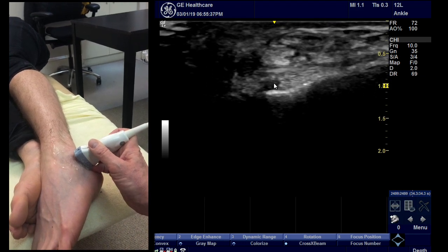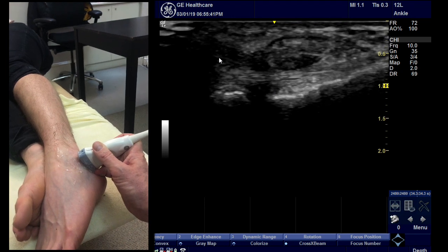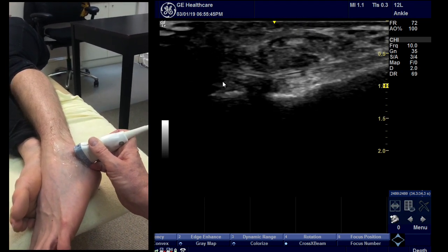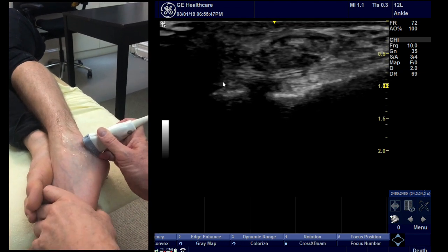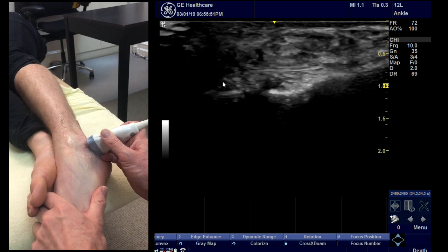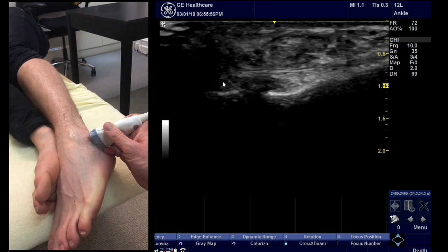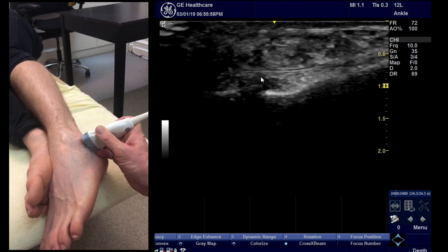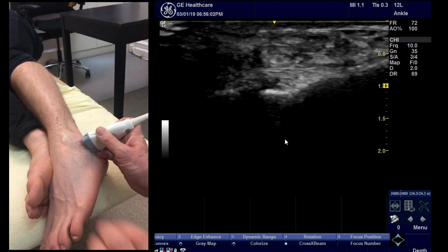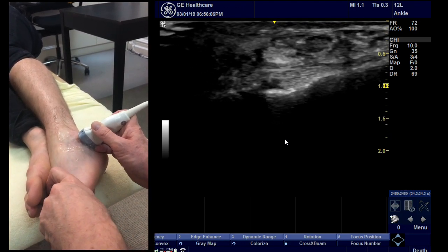Scan through the ligament. The image quality is poor here where the fibula head is disappearing. To tension the ligament you can do various maneuvers: inverting the foot will lift the peroneal tendons nicely — these are the peroneal tendons here. Everting can sometimes help you differentiate the structures.